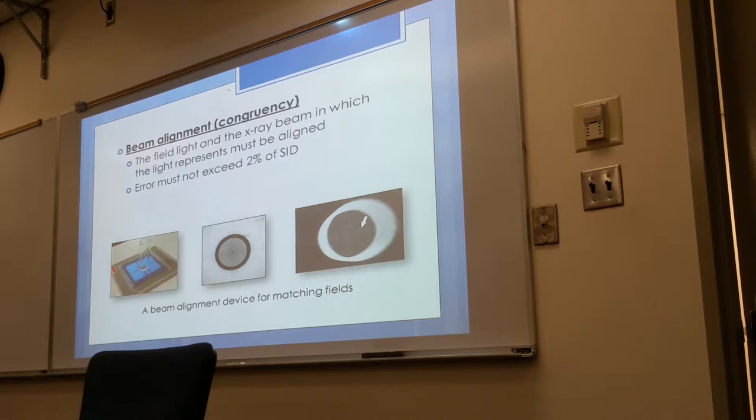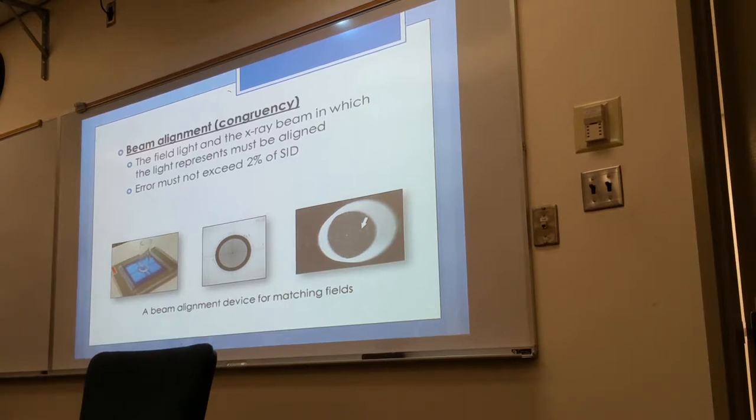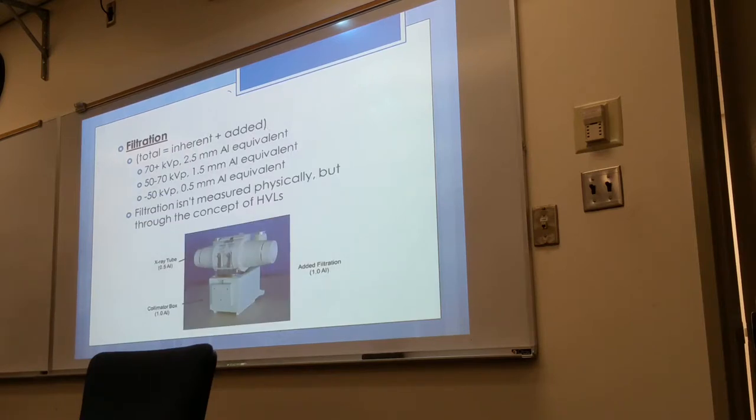Like the intensity of it? Okay, yeah, but we're not talking about intensity right now. So all we're talking about simply is beam representation. But you're absolutely right. With wear and tear, it is going to change the intensity of the beam. Eventually, you're going to have to keep kicking up your technical factors to get a certain density on your image. But we're talking about normal wear and tear that happens later on down the line. Okay, gotcha. All right, filtration.